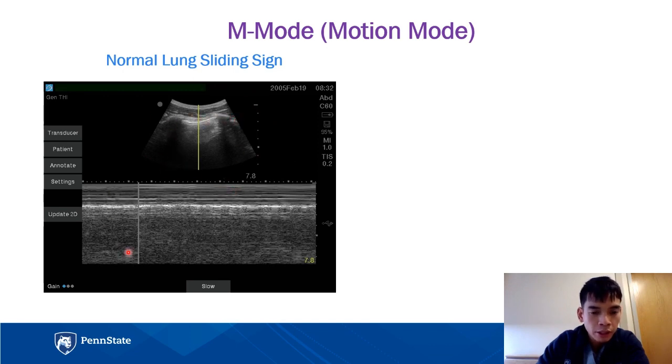But really, we're going to look at this portion right here. From top to bottom, this relays information from top to bottom. It takes the average of whatever motion may or may not be on screen and throws it into this schematic right here. So anything that's stagnant, not moving, on your initial ultrasound will project itself as a horizontal line here, okay? And anything where there is movement will create noise, and that noise is then projected as the stippling image right here.